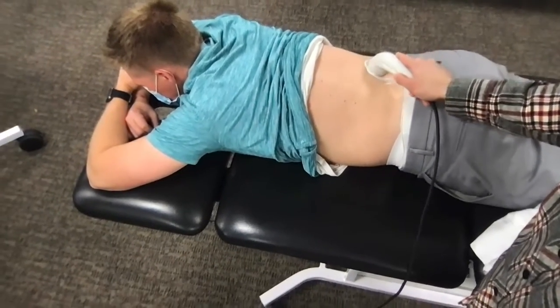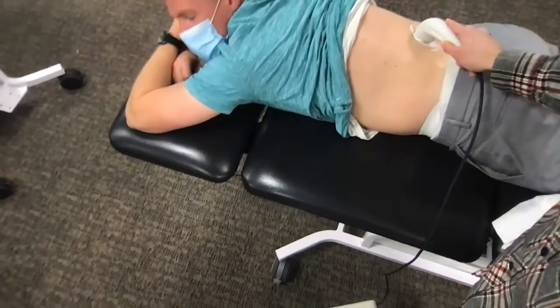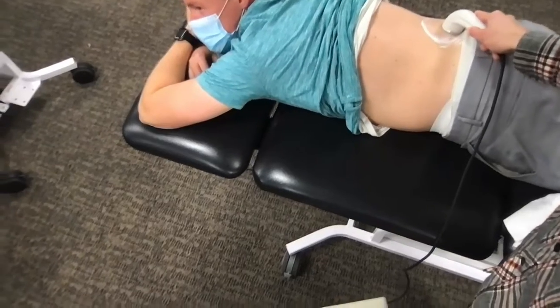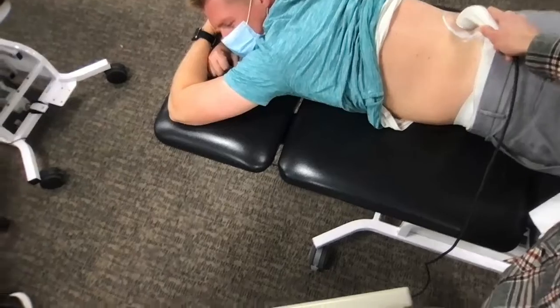Okay. Do you feel anything, Bonnie? Yeah, it's a little warm. A little warm? Okay. Just let me know if anything changes. You shouldn't feel any amount of discomfort, all right? Okay.